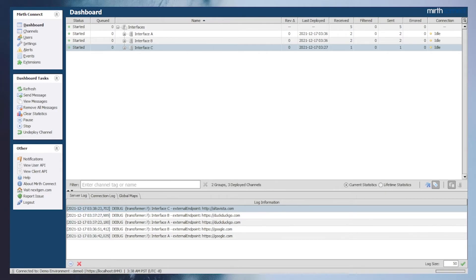The precedence list can be referenced in the MirthConnect user guide. I'll go ahead and add a link to the MirthConnect user guide in the video description down below.